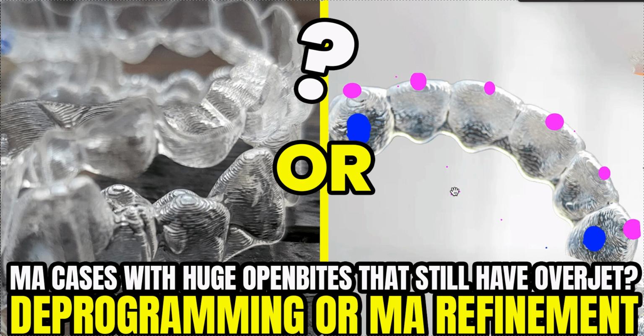Today we're going to go over this little conundrum. What happens when you have an MA case and you get this massive posterior open bite? Sometimes you get it, depending on where they're placing the wings. Sometimes you get it in a mixed dentition case just in the premolar or baby teeth area. Sometimes you get it in the whole back, including the sixes and the sevens.